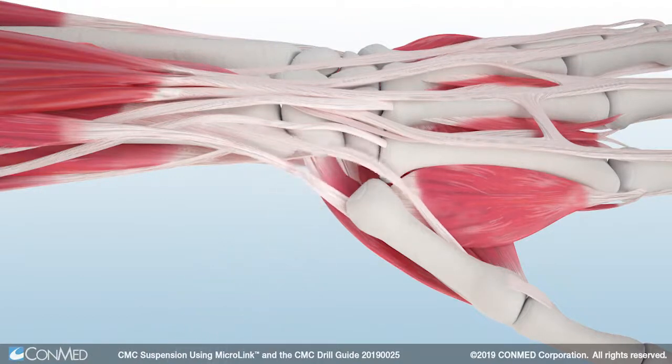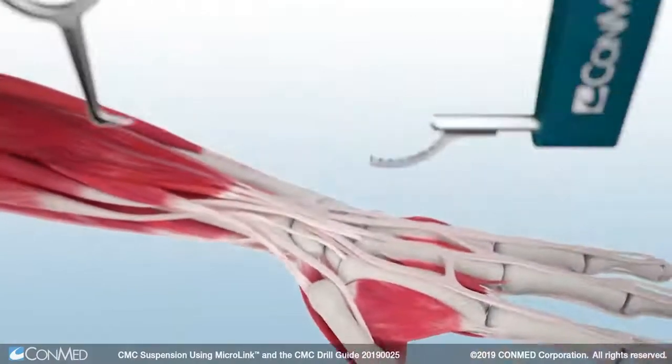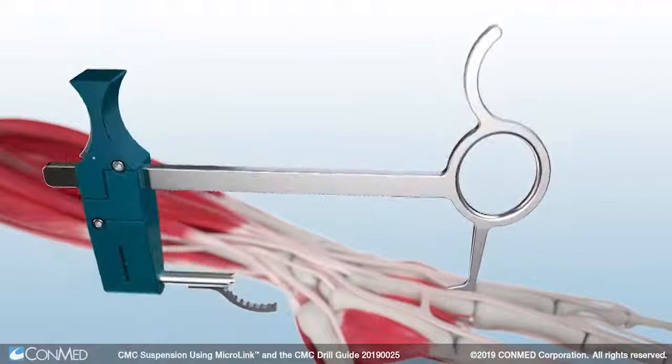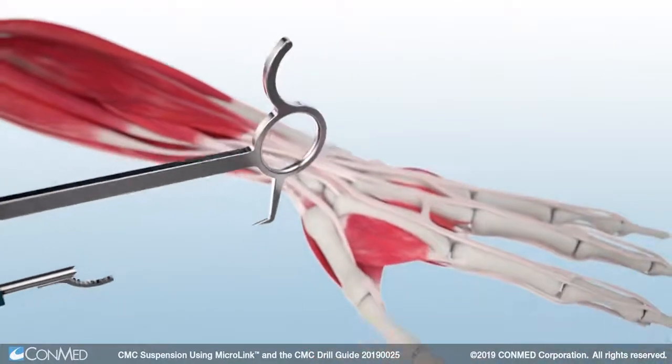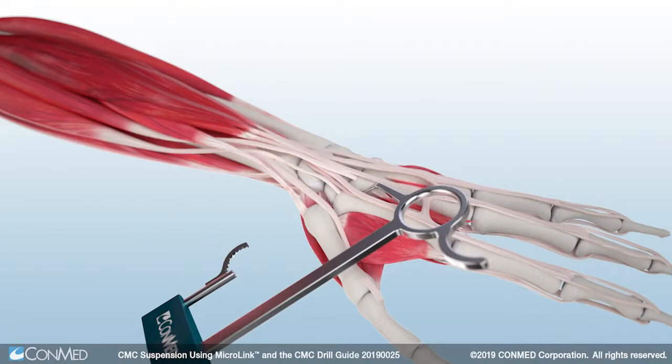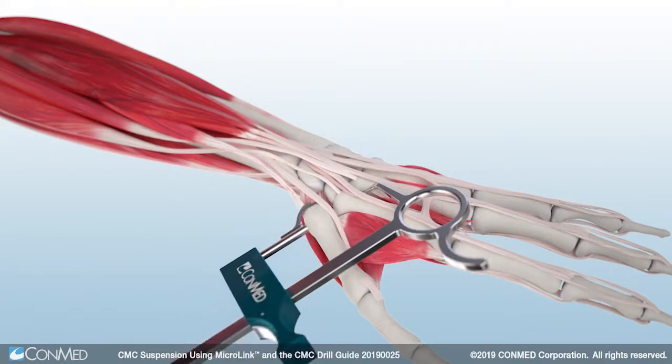The extensor tendon should be reflected ulnarly. Next, the Microlink CMC drill guide is used to assist in precise tunnel drilling. The drill guide with paddle can be placed volar to the base of the thumb, with the distal tip of the guide positioned in the metacarpal flare, distal to the middle and index finger articulation.